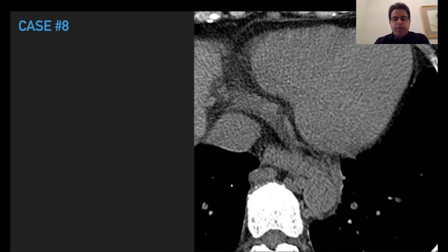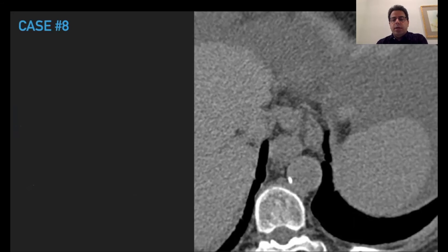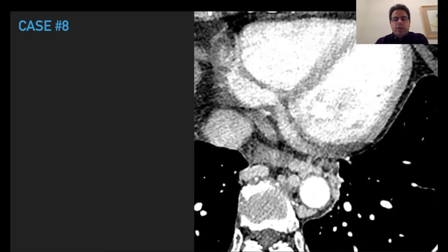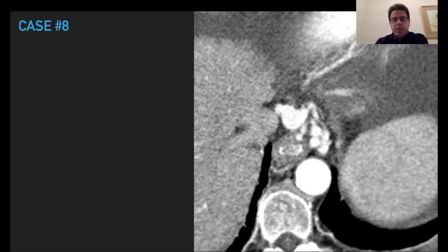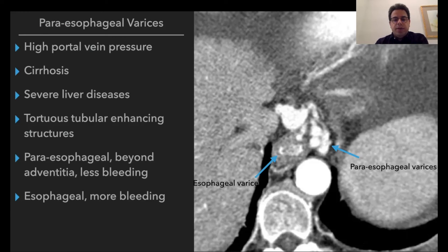Case number eight: there is a lot of soft tissue nodularity around the aorta on non-contrast CT, which at first may suggest lymphadenopathy. Lower down, more soft tissue is adjacent to the aorta, and there is a little bit of ascites with a nodular liver. Post-contrast shows significant enhancement of these nodularities. Considering the cirrhosis and ascites, these are most likely paraesophageal varices, with some areas appreciable as variceal structures. The tubular pattern of enhancement and abdominal findings help differentiate this case.